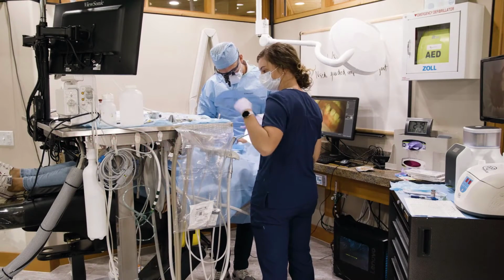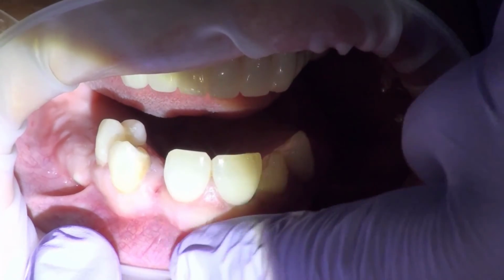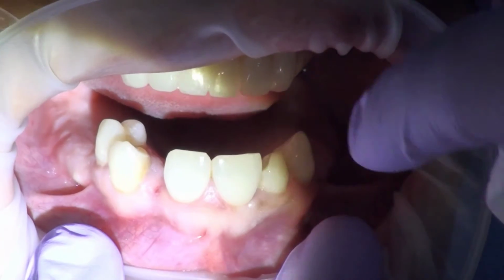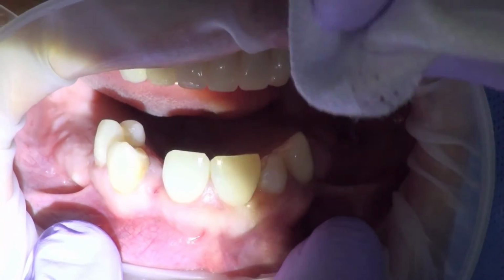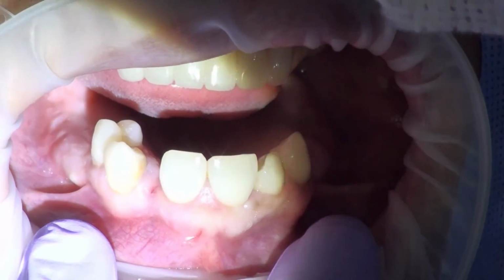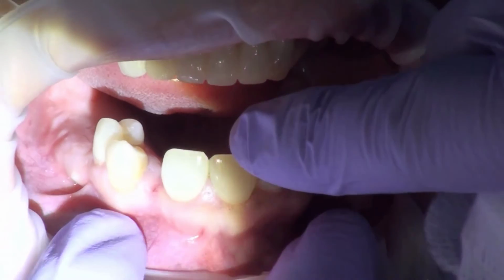So we've got our patient here. She is lightly sedated. I went ahead and put just about a carp in the buccal and maybe a quarter of a carp at the palate. I used Septocaine 4%, 1 to 200,000 epinephrine, and just waiting for it to soak in a little bit.